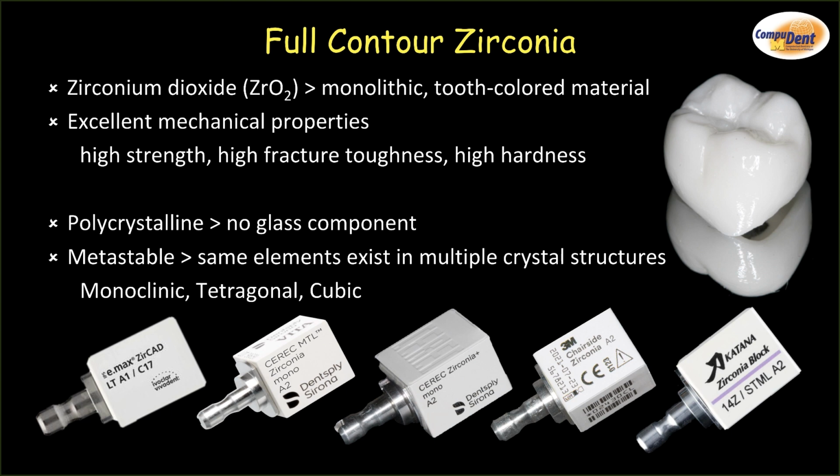Now, the other material that people are going to gravitate to for these short clinical crowns is a full contour zirconia. Now, both of these materials, the high-strength ceramics and the zirconia, allow us thinner reduction, as we talked about earlier. Both of them are the material categories that have the higher strength. Again, since we have less dimension, it's an advantage from that perspective.